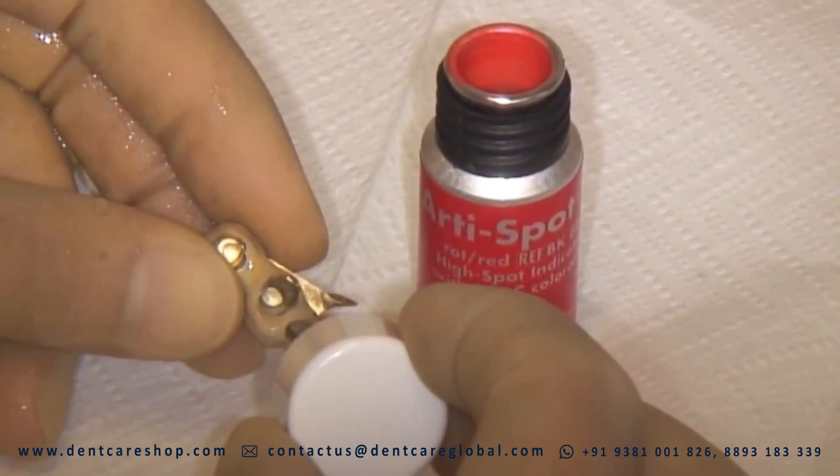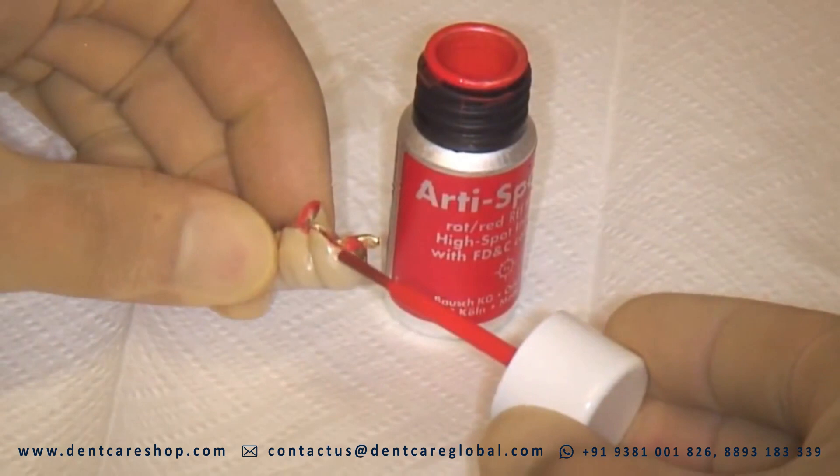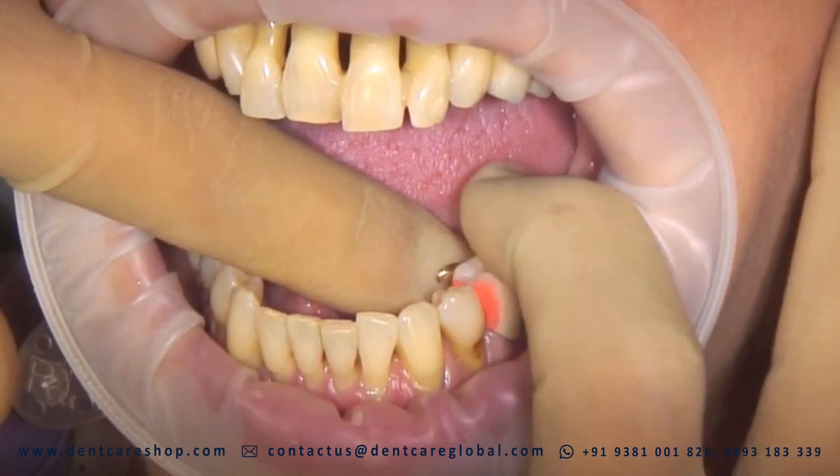The application is easy. Artispot is applied to the test surface with a brush. The solvent evaporates in seconds, leaving a thin film 3 microns thick. Every contact destroys the color exactly at the point of contact. The base material then shines clearly through and high spots can easily be detected.